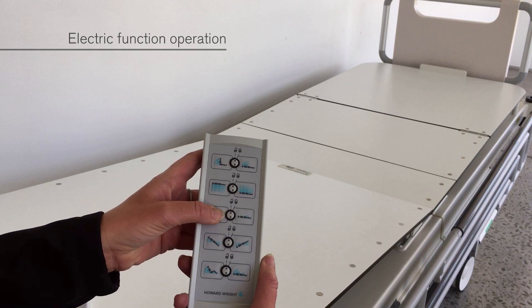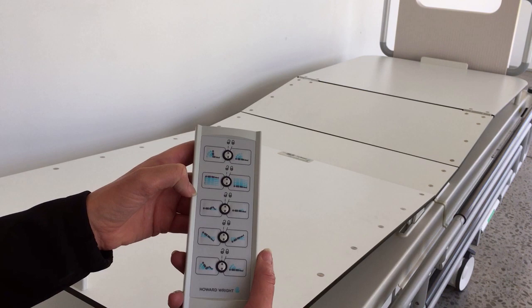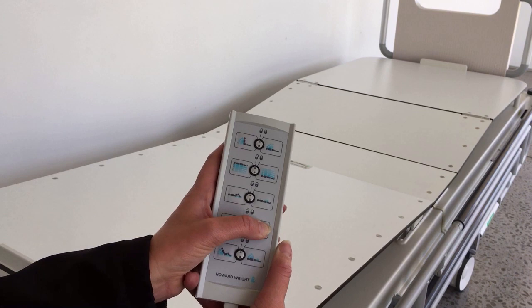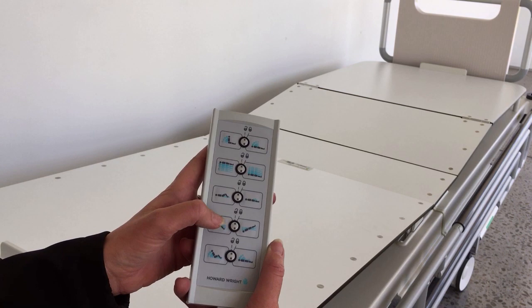To raise and lower the backrest, legrest or deck, press the appropriate button. To tilt the deck, press the head up or head down button. When transitioning from head down to foot down, or from foot down to head down tilt, the deck will pause at the level position before continuing.